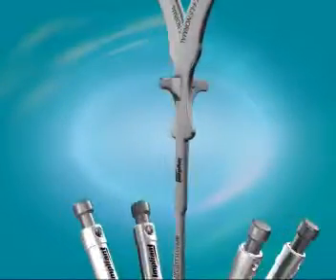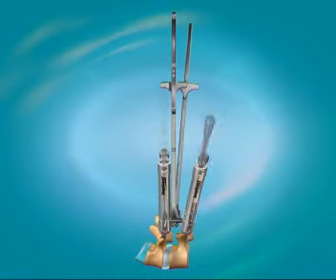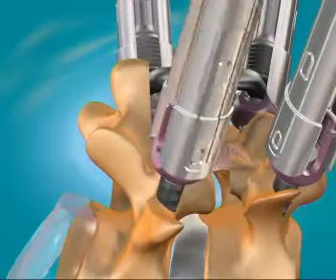To make an adjustment, the gauge and temporary set screws must be removed and the screwdriver applied. Note that because of the conical core of the pedicle screws, it is better to adjust the height by advancing the pedicle screws as opposed to backing them out.